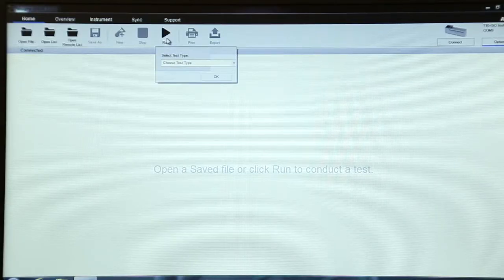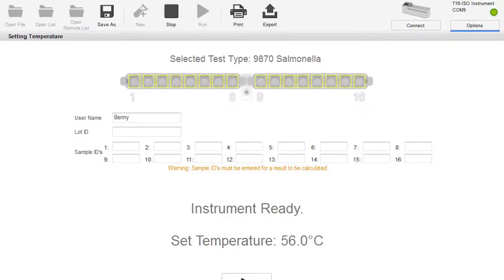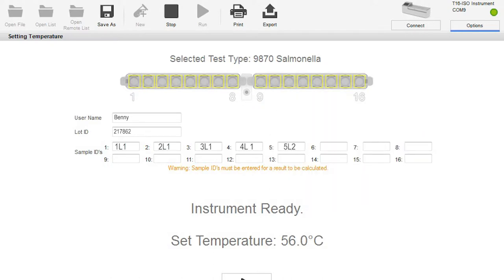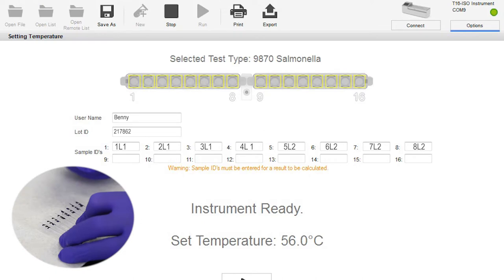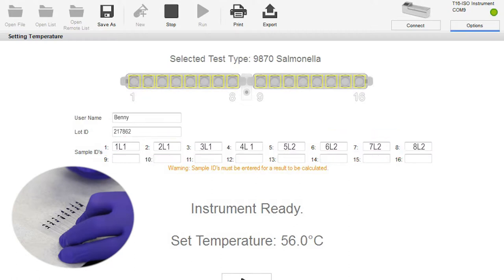Remove your gloves and, from the computer, select Run. Select 9870 Salmonella from the Test Type drop-down menu, then click OK. Fill in the username and lot ID from the kit and corresponding labels from your samples in the sample IDs. These should match the cluster tubes as well. If you do not put in a sample ID next to the well number, the reader won't read it even if it has a sample. Be sure to provide an ID for every well you're running. In this case, we are only running 8 samples, so wells 9 through 16 are empty. Any number of tests can be run at once. It does not have to be in multiples of 8.